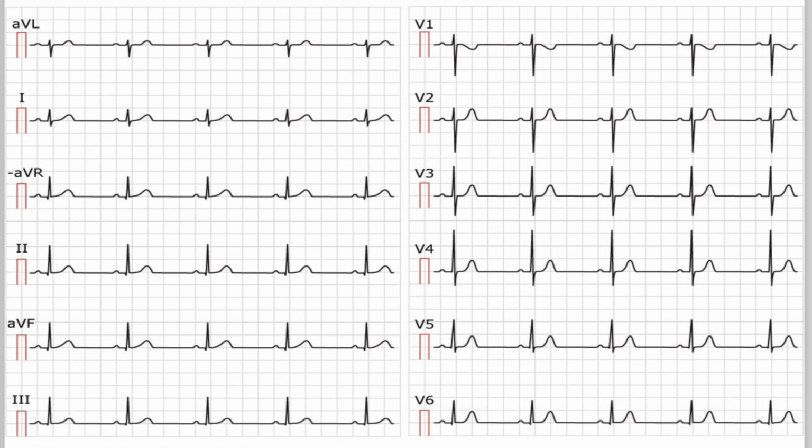Therefore, the configuration of a normal rhythm tracing from lead 1 will differ from the configuration of a normal rhythm tracing from lead 2. Lead 2 will differ from lead 3 and so on. The same is true for abnormal rhythms and cardiac disorders. To make an accurate assessment of the heart's electrical activity or to identify where, when and what abnormalities occur, the ECG needs to be evaluated from every lead, not just from lead 2.